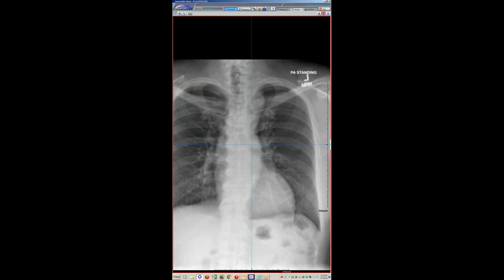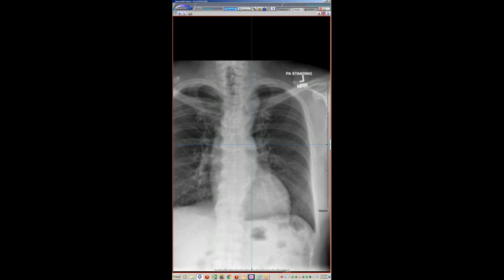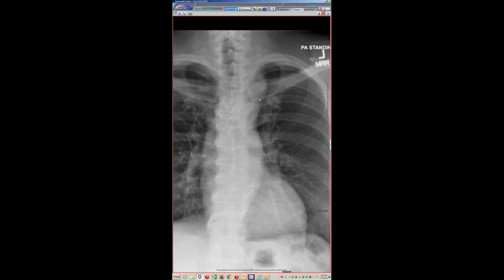That seems like a suspect history. It totally is. It's like the foreign body that ends up in the rectum because it just happens to be vertically oriented. We were like, at what point did your mom get upset at you when you were sewing, or did you steal her sewing equipment, or was this some sort of torture? I don't know, but we're sticking with the fall from the third stair straight onto a sewing needle on the ground.